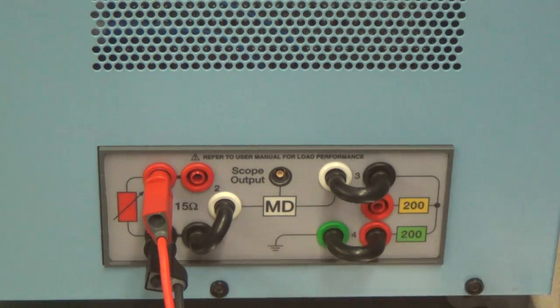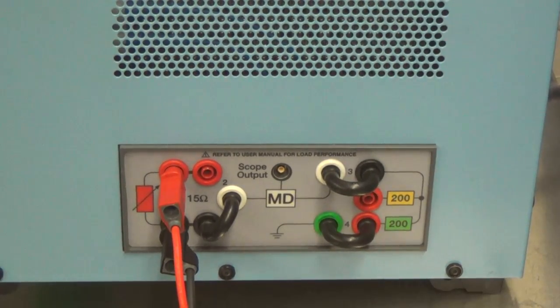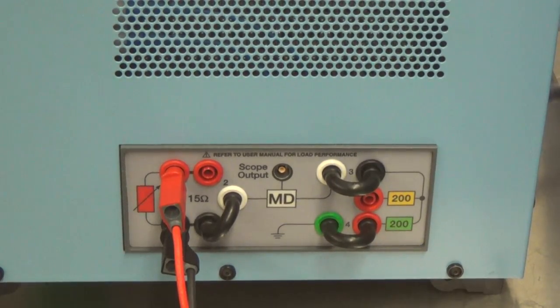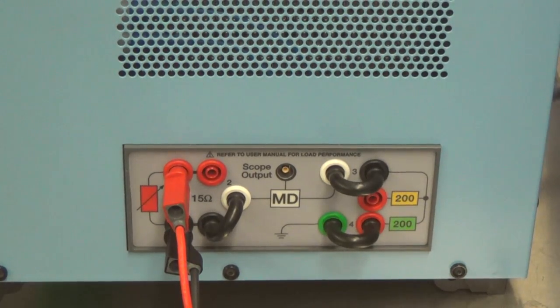So this is very beneficial. Five years ago, I used to have to put a big Dale 1% 200 ohm 100 watt resistor right here, and I'd have to connect with clips, and those clips weren't insulated, so you could accidentally touch that, and when you were running this test, you could actually get burnt, just as they're trying to prevent a patient or a staff member from getting burned. You could get yourself hurt by doing this test.